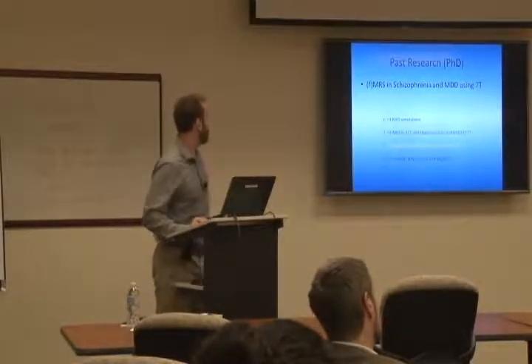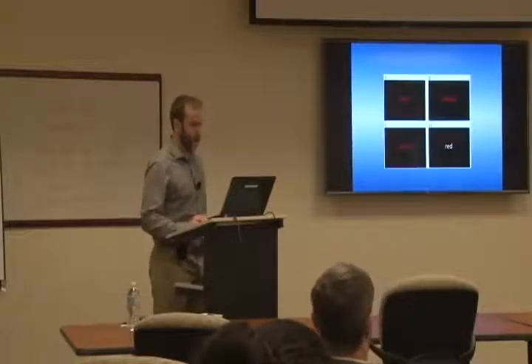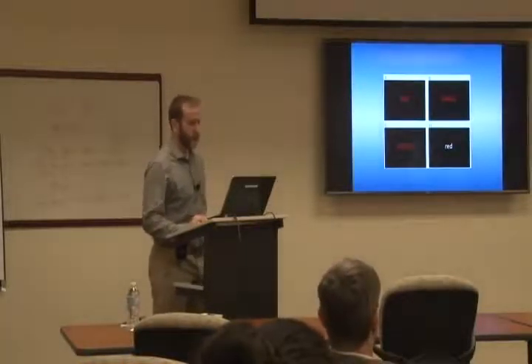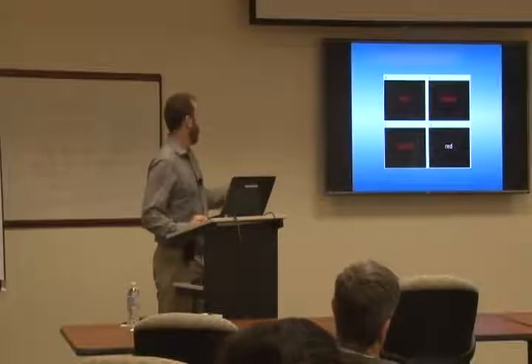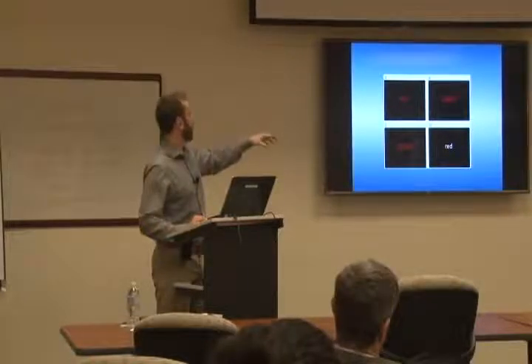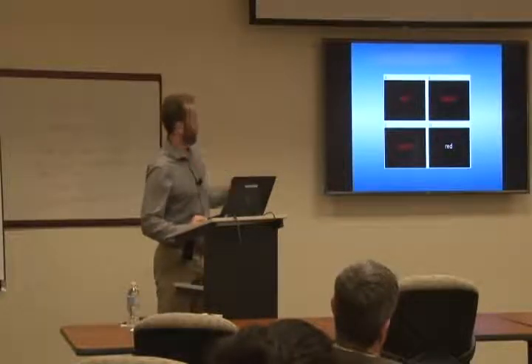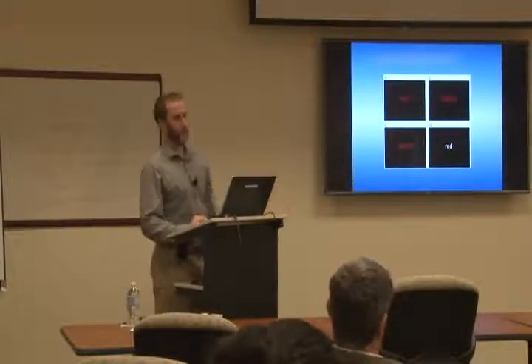And then we ultimately wanted to do functional spectroscopy. So just as proof of concept, we did that in healthy controls. We used a modified Stroop task. There were 4 conditions. The first one was congruent, where they match up. Incongruent, where the word and color don't match up. Color only and word only. In all these examples here, the answer would be red.